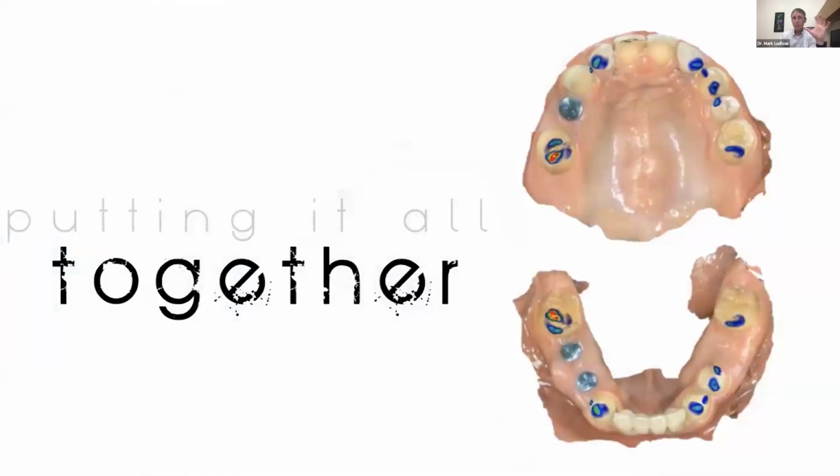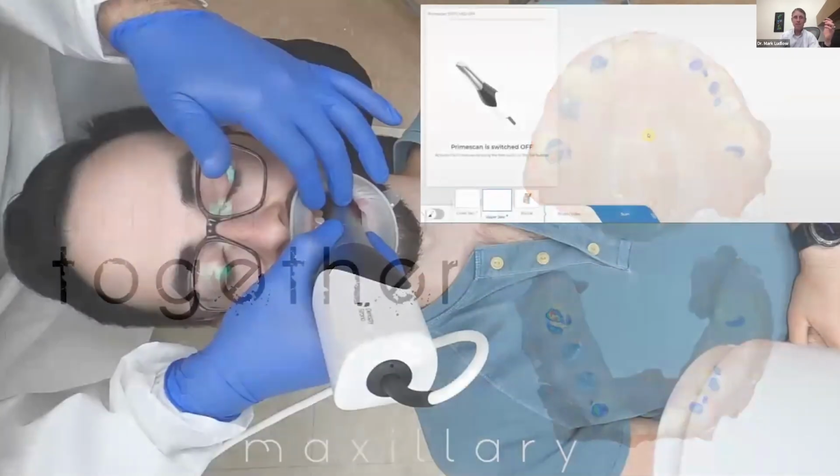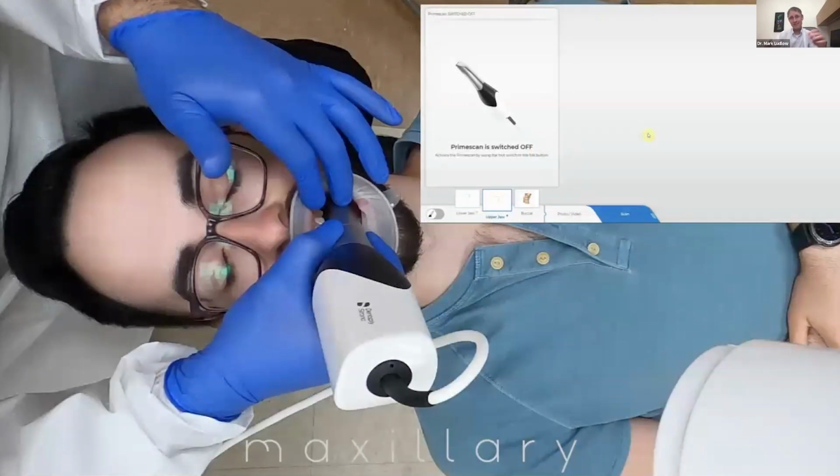Now, let's put it all together. This is just some basics to help you scan, especially if you're in the very beginning stages of scanning or you haven't scanned at all. The first thing is this. We're going to look, again, at the same patient we took all the scans on, and we had multiple cameras going on at the same time with him.